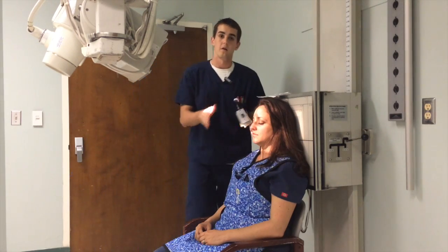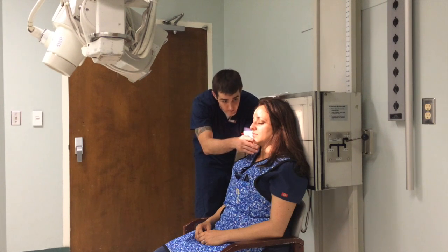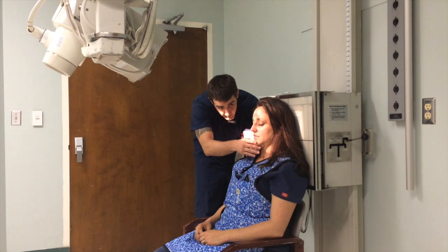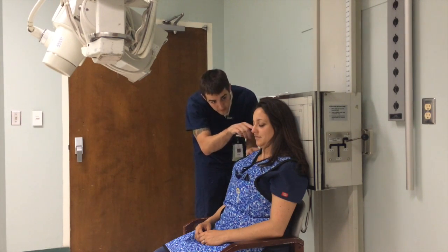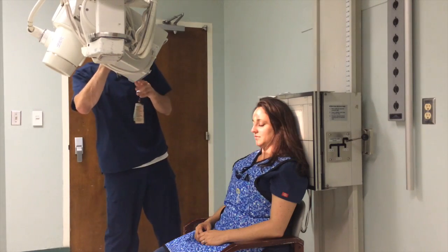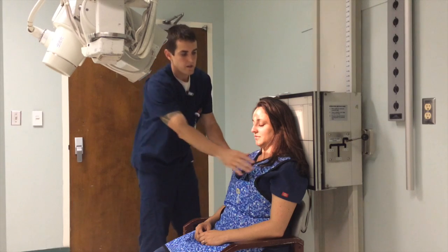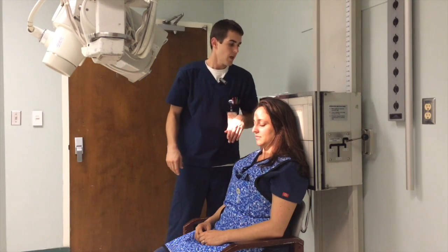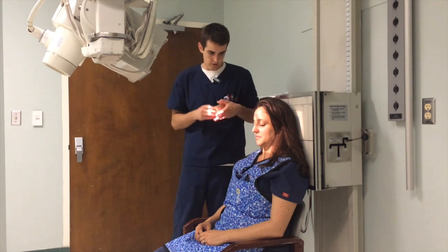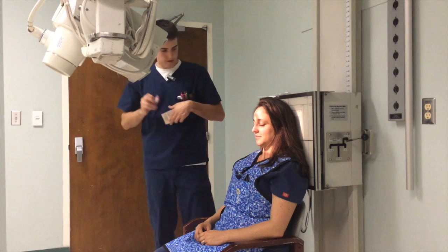Again, we want the OML perpendicular with the IR. There, so that's perpendicular. Our central ray is entering 1 inch above the nasion. We have our mid-sagittal plane perpendicular with the center of the IR. And we have your patient shielded. We're going to put on our right marker.